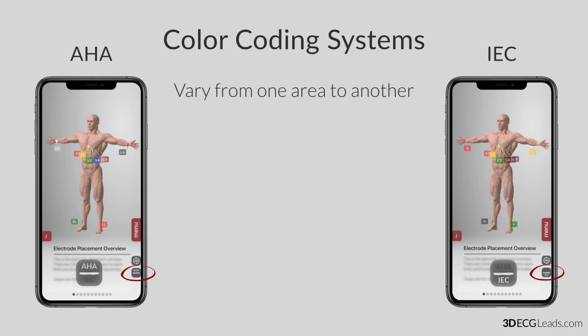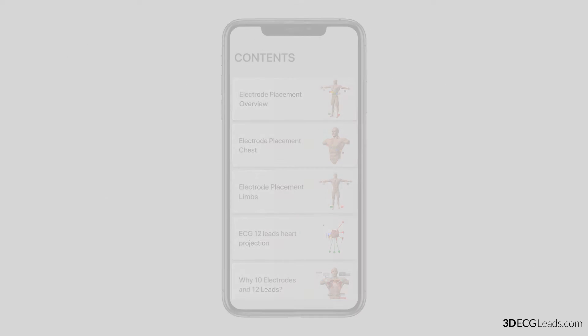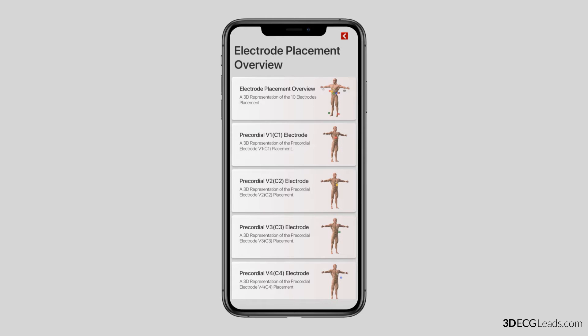Please remember, they are not confined 100% to a certain area, and that before performing any 12-lead ECG, you must always check the color coding standard that is described on your 12-lead ECG machine. Now let us have a look at each of the limb leads one by one with the color coding system.